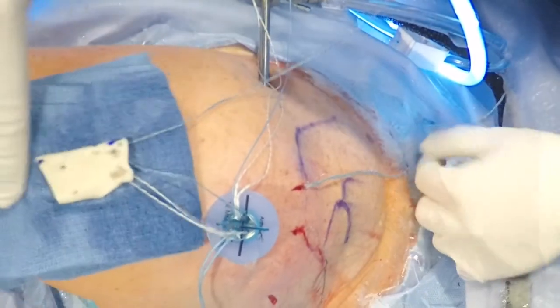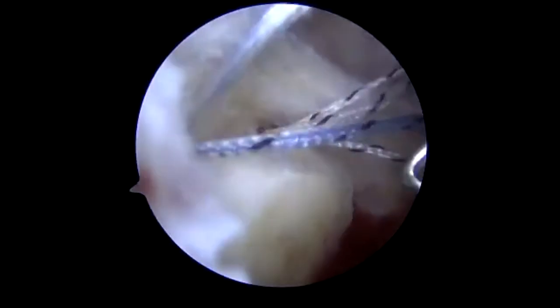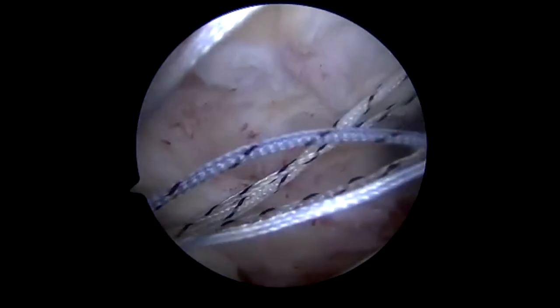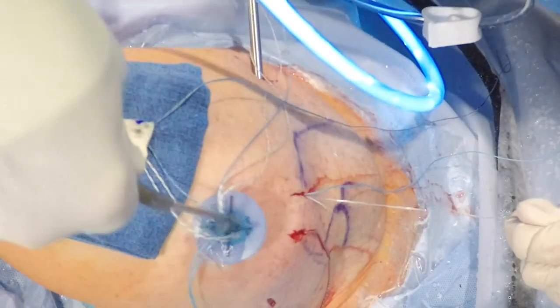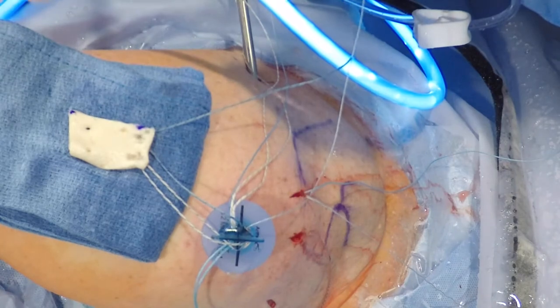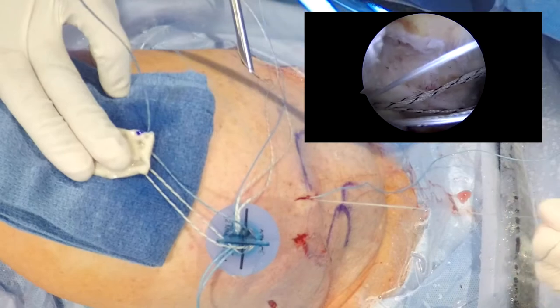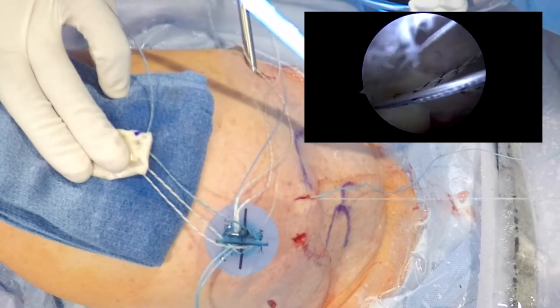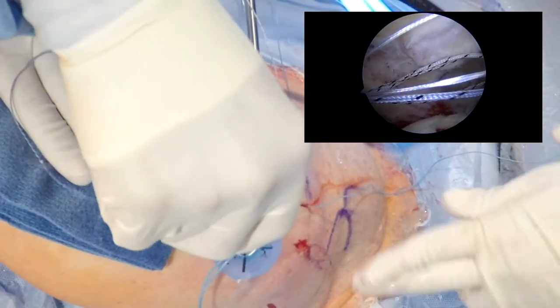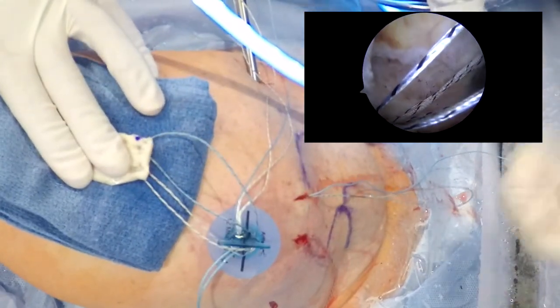We will go now through the more medial posterior quadrant and again grab the shuttling stitch. The suture from the dermal allograft is then placed through the loop, and now we will pull that through. This will essentially secure the medial aspect of the construct, so that once we insert the allograft for the superior capsular reconstruction, we will be pulling on those sutures and anchoring them down.